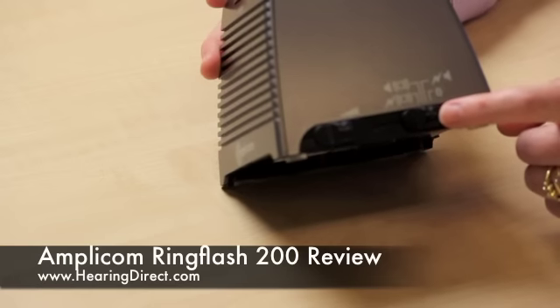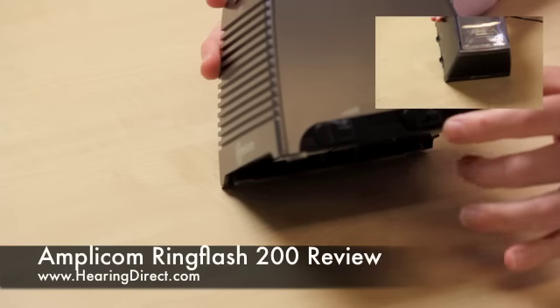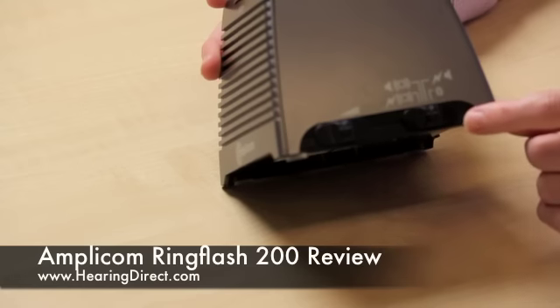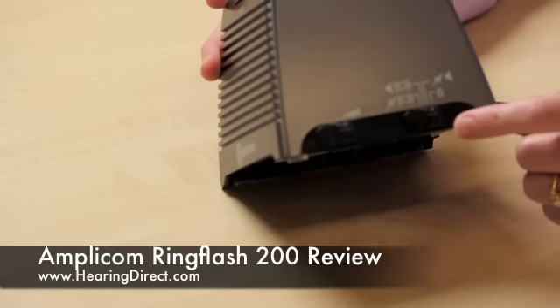The RingFlash 200 has a very bright flashing light — it's an incredibly bright white light. It also has the facility of being connected to a shaker unit, which needs to be purchased as an optional accessory. That can also be plugged into the RingFlash and alert you via vibrations that either the telephone is ringing or the doorbell is ringing.